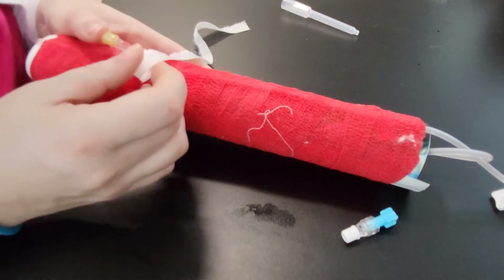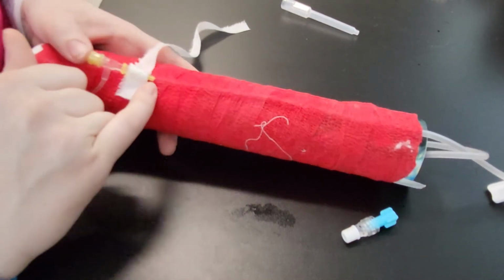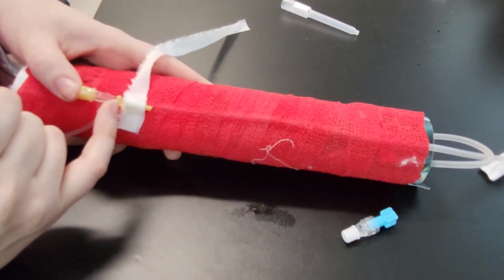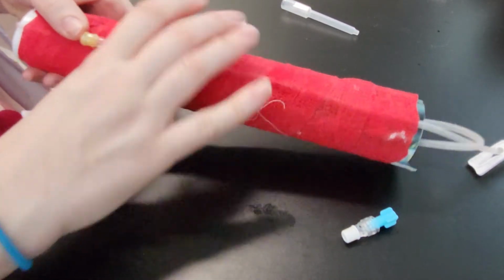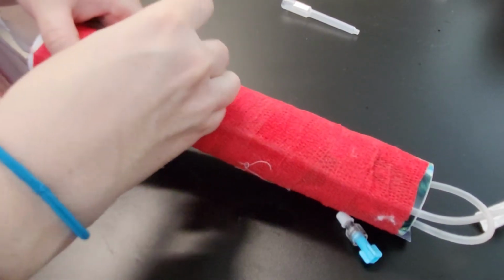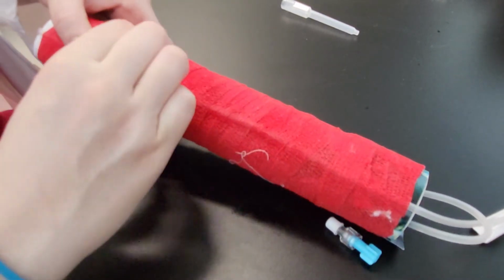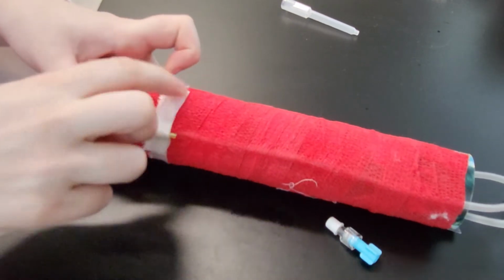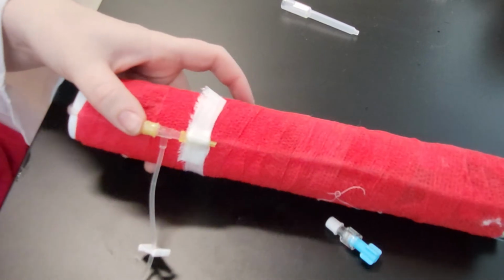Now when you're folding your tape over, we make sure that the tape for this beginning portion is not covering the insertion site of the catheter itself, as well as the flanges on the hub of the catheter. So we still want those to be visible during this portion of the taping. And this is when we're going to tape around the leg and then secure it. Always put tabs at the end of your tape to be nice to the people who may have to rip this catheter out later. So I pinch it down, make sure everything is nice and situated, and that is how your first piece of tape should look.